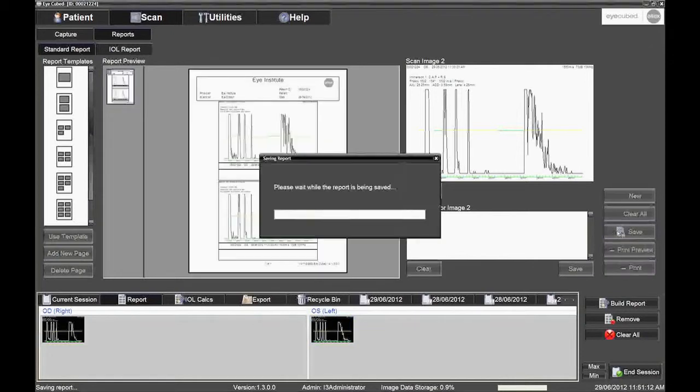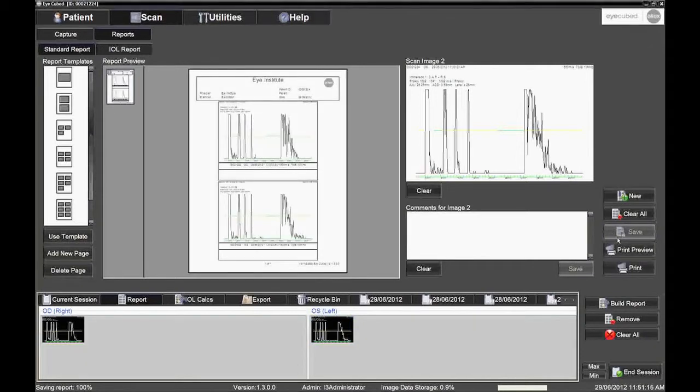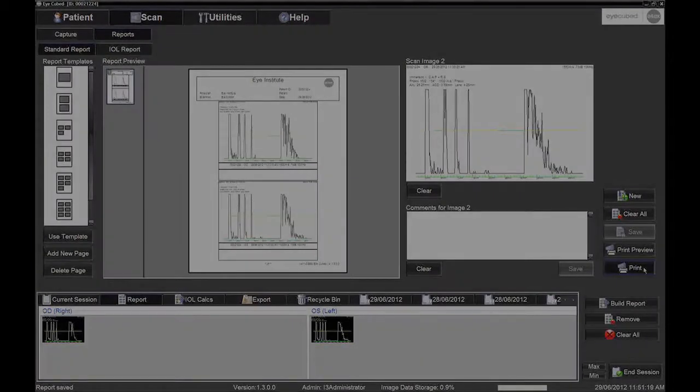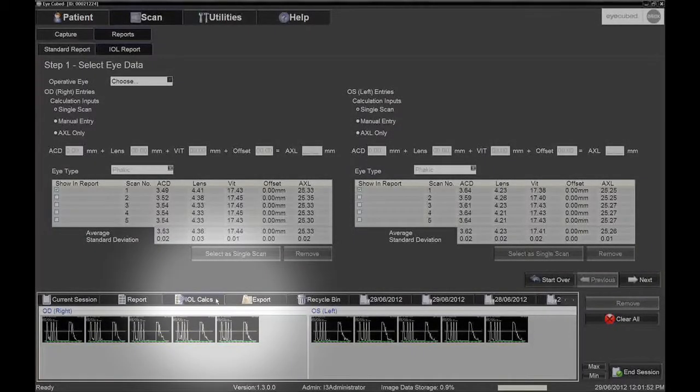To print the biometry scans which include the IOL calculations, proceed with the following. Click the IOL Calcs tab directly above the image tray.